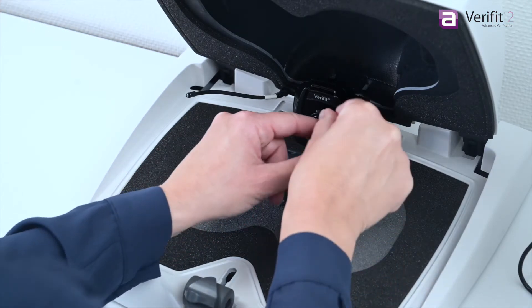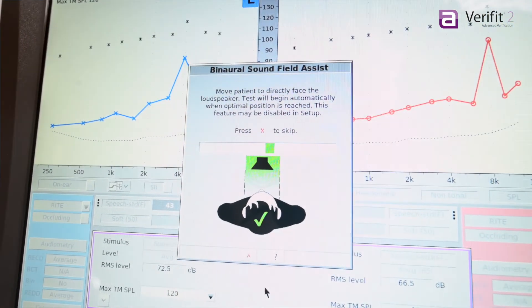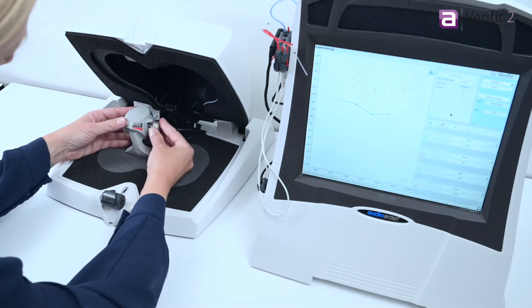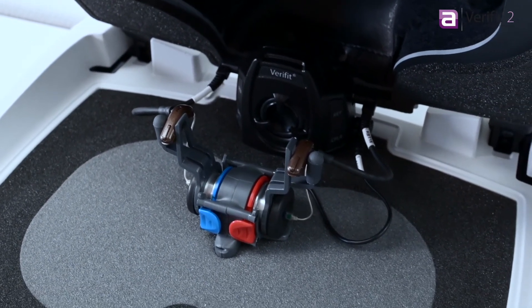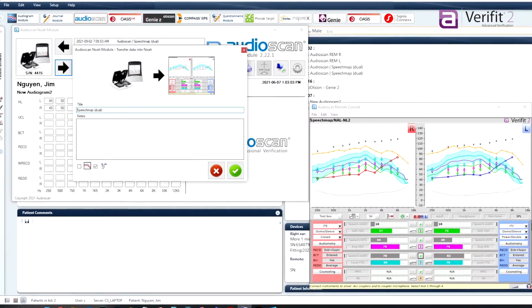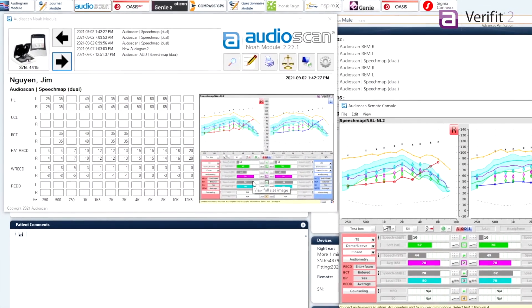Verifit2 offers even more advanced features such as simultaneous binaural measurements, the Verifit Skull Simulator for bone anchored hearing devices, binaural simulated real ear measurements in the test box, and easy integration with your office systems. All of these features make Verifit2 the perfect choice for advanced verification.